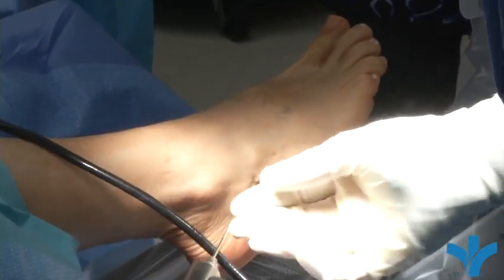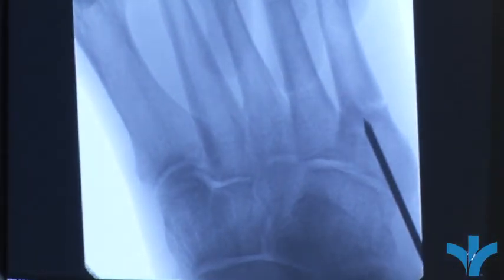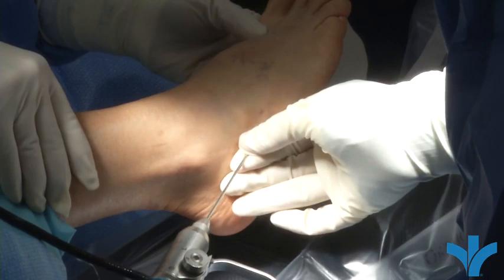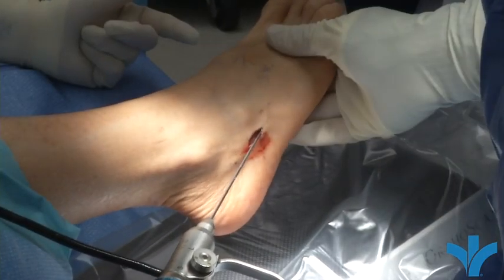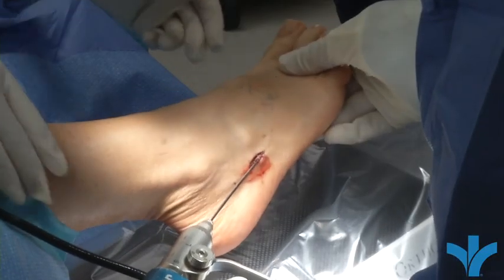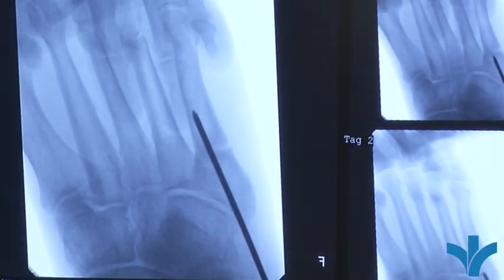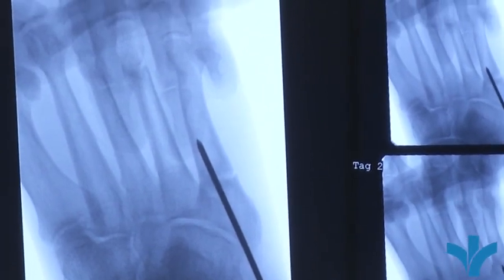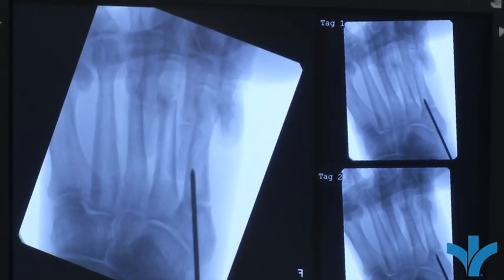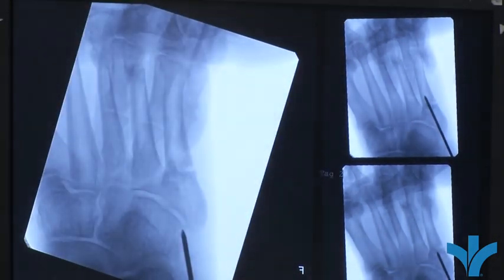Here's the guide wire, and we'll try to put it in the perfect position under x-ray. The so-called 'high and inside' position is where we want to be — there's a perfect starting point in the bone. You can see the guide wire going down inside the canal of the bone. It's a little on the inside, so we're going to re-advance it to get it more right down the pipe. It's important to start well, because that's what helps you end well.